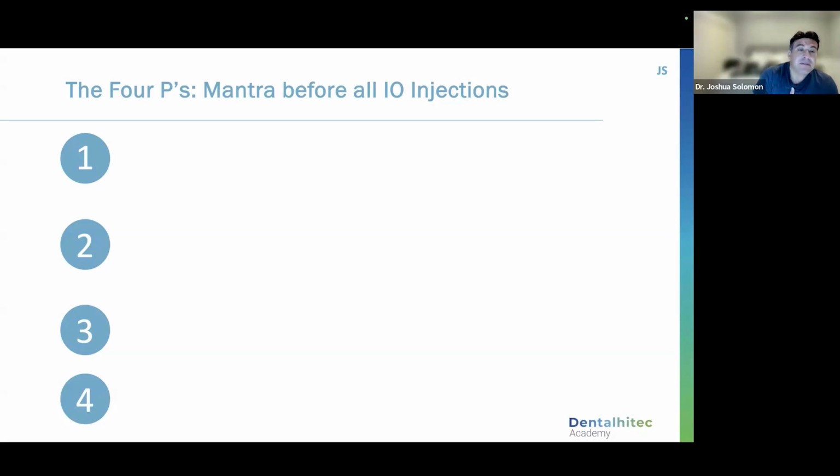In my hands, I typically will find at 13 or below, I can usually penetrate through bone, as long as they're not like a big football player, 300-pound kiddo in my practice. But most patients I find 13 and under, I can get through. But for your 15, 16-year-olds, don't be dismayed if you can't penetrate through that cortical plate. It may be that this is not the right device and you need to do something different. If you can penetrate, just know that you may only get 2 teeth numb, 1 tooth mesial and 1 tooth distal.